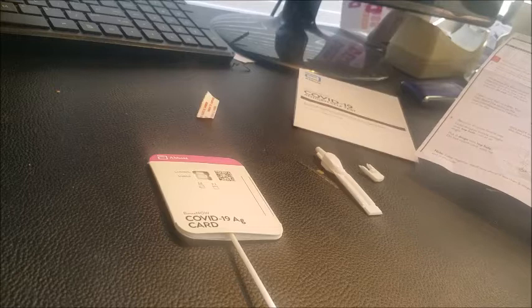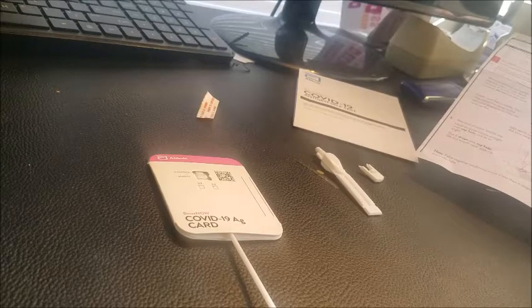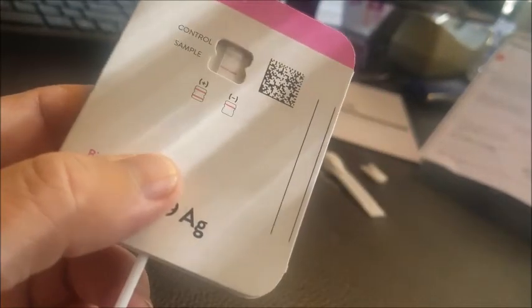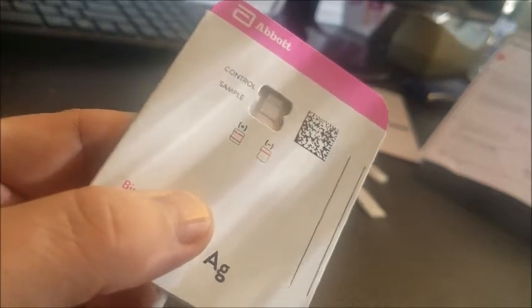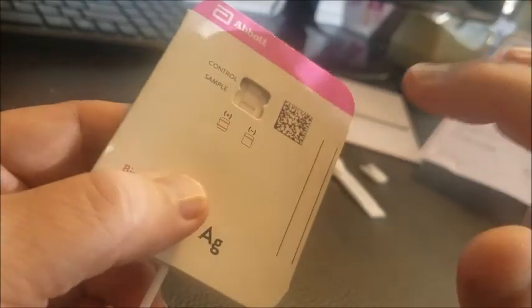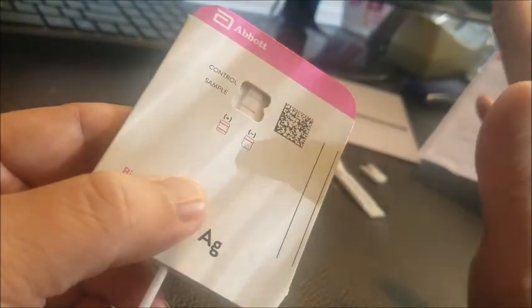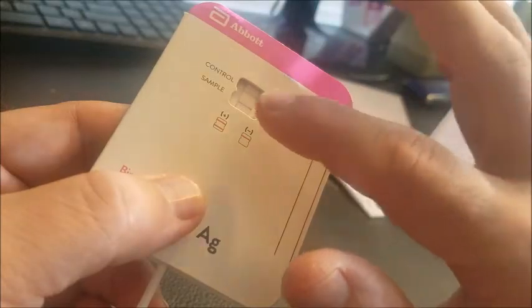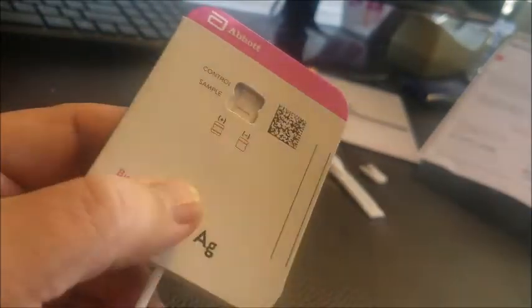It's been 15 minutes. You want to make sure you don't wait more than 30 minutes for the test to be completely accurate. And as you can see here, I've got two pinkish-purple lines — one on the top and one on the bottom. Unfortunately, that means that I'm positive for COVID-19. Here's what the results mean: if you get a purple-pink on the top and nothing on the bottom, that means you are negative — just one line means negative. If there's even a slight hint of a line of pink or purple on the sample on the bottom, it doesn't matter — that means you're positive.